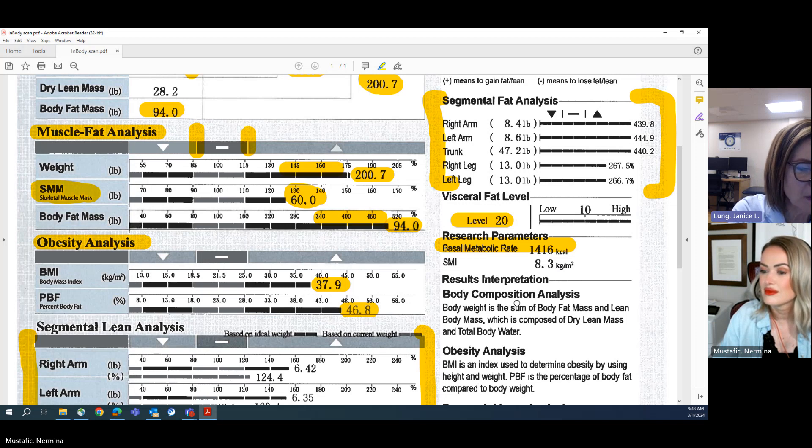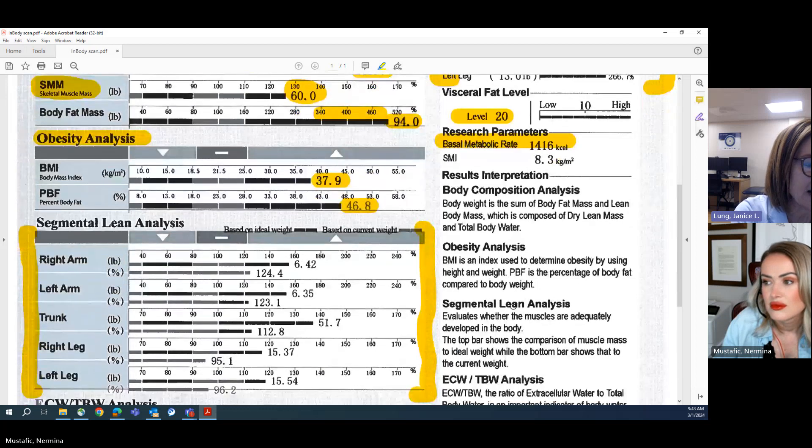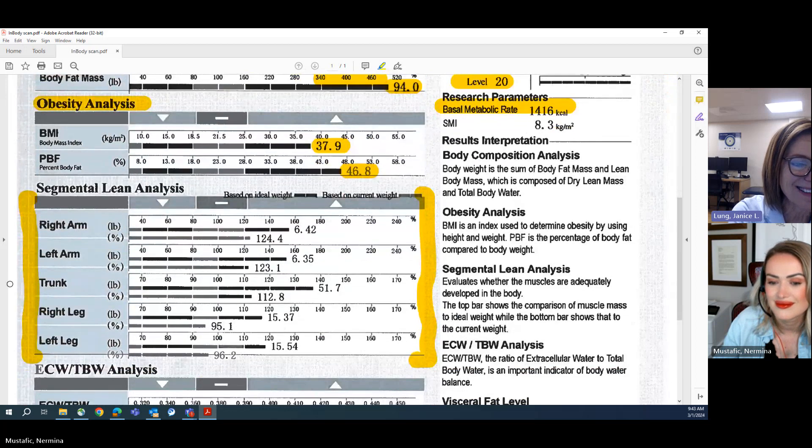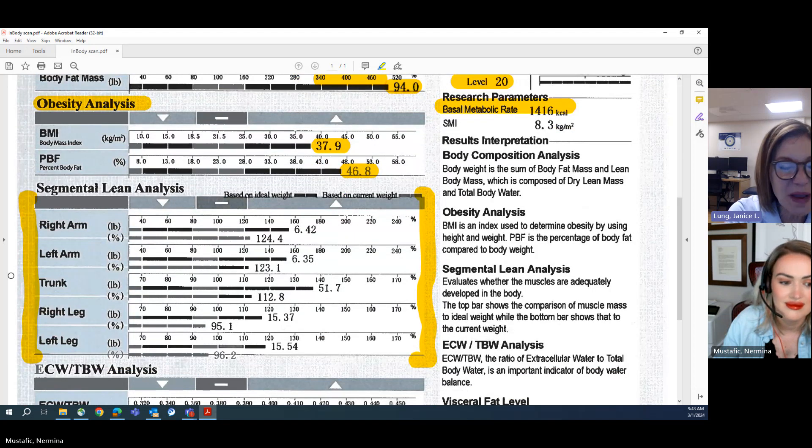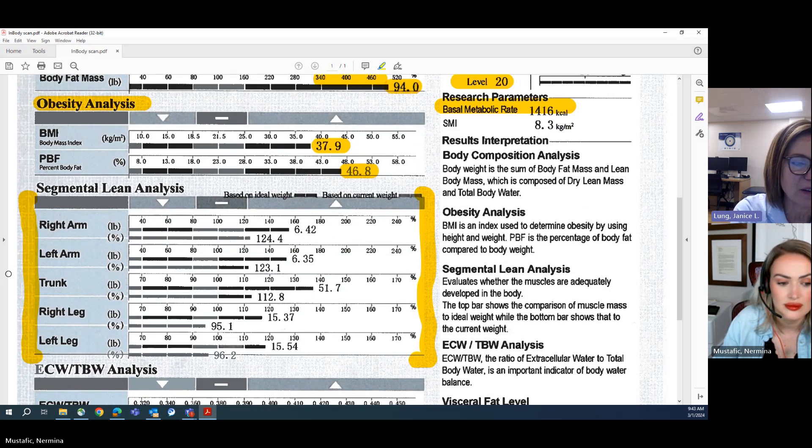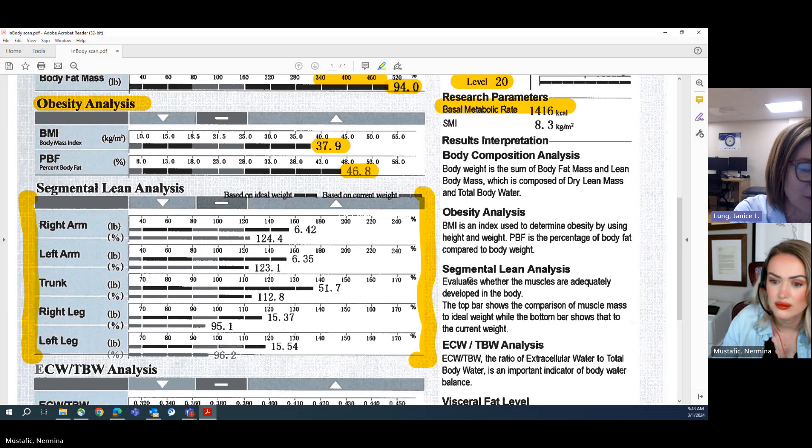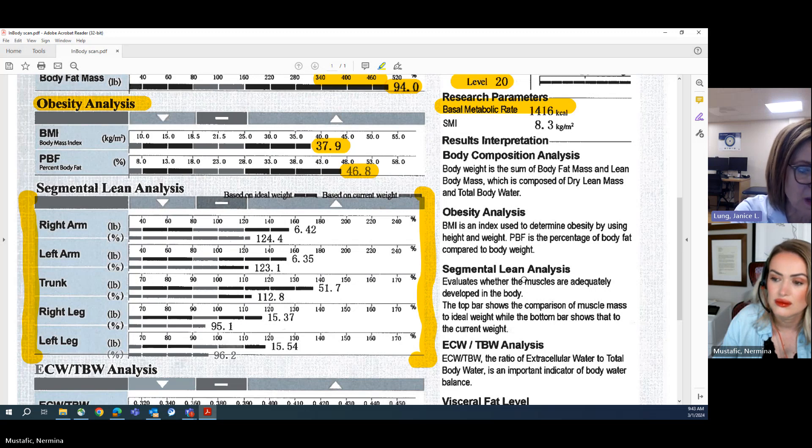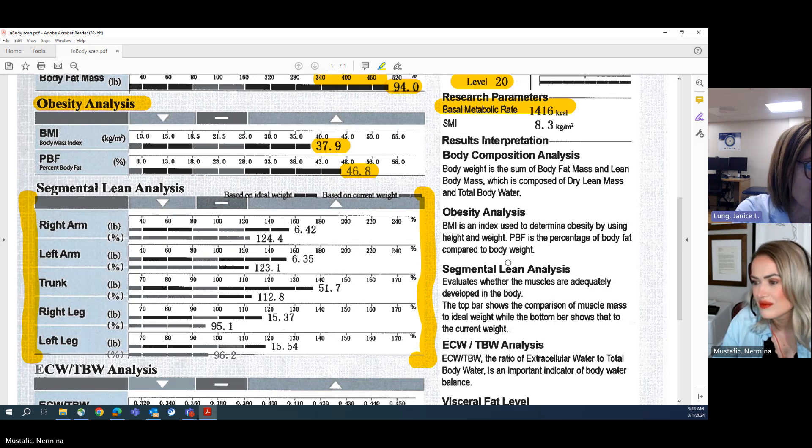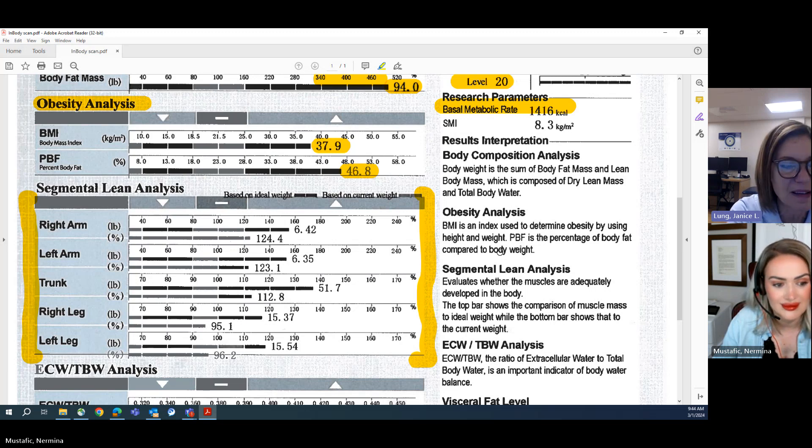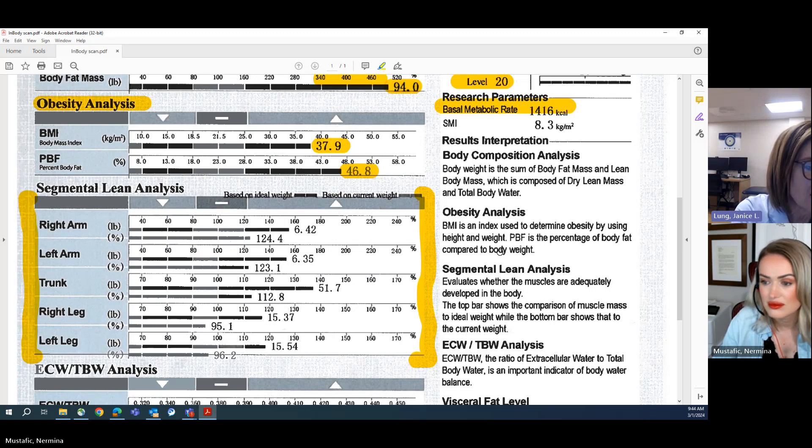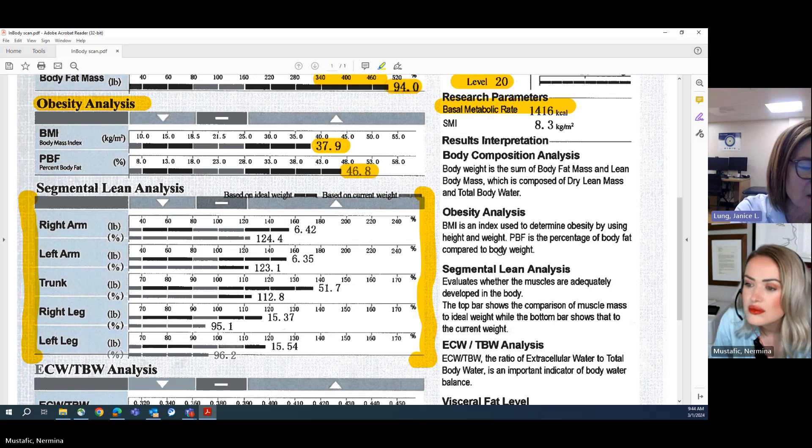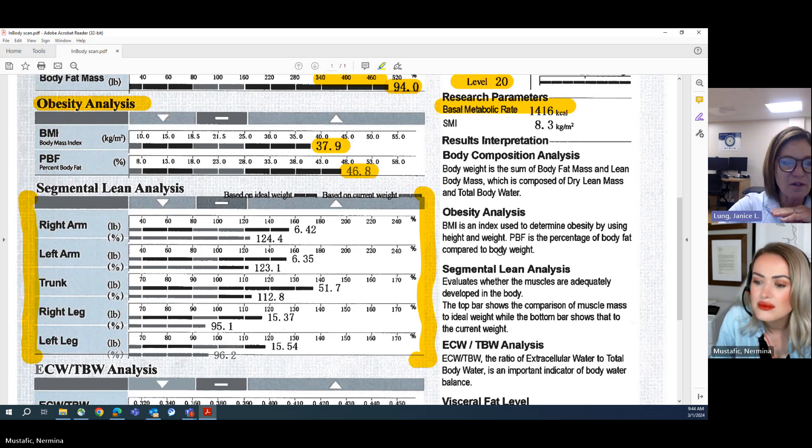If we scroll down even further, we see the segment lean analysis. That's just one of the bells and whistles of InBody. It's not exactly informative, it's just interesting to see. We can see the distribution of lean mass throughout this person's body. In her right arm alone, she's got 6.42 pounds of lean mass in her right arm alone. And that's outside of the healthy range, which is of course a sweet thing. It's at 124.4%. So that's pretty cool. This person can see that she's got just a smidgen more lean mass in her right arm than she has in her left arm. I'm guessing she's just right arm dominant, so no big surprise there. This person has 51.7 pounds of lean mass in her trunk alone. And the trunk, as we know, is everything from her neck down through her torso. So it's just interesting to see that.